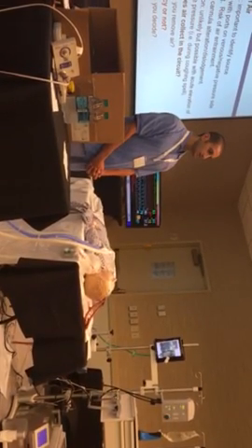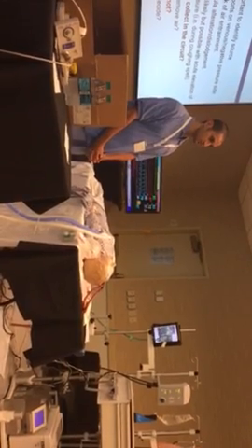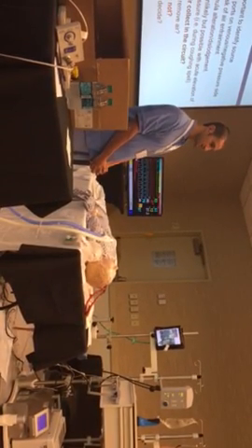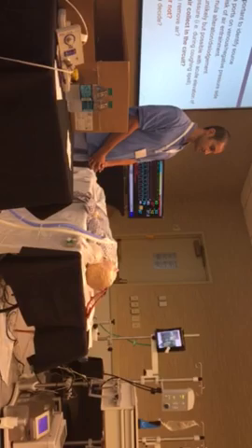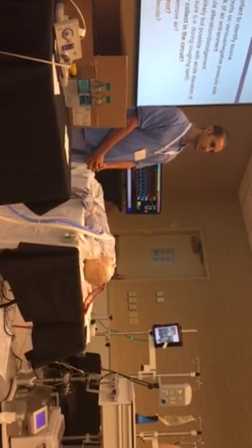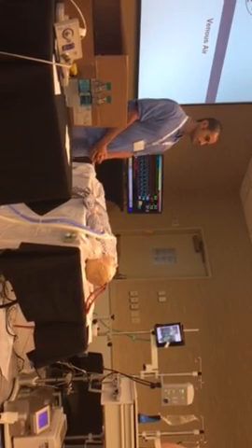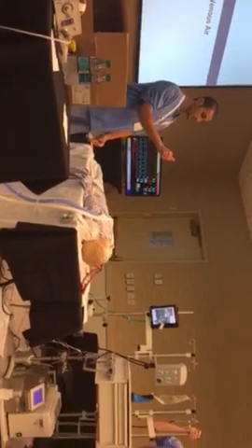Good. So air embolus in ECMO is one of those cases that we consider emergency, right? ECMO emergencies. There's a few reasons to clamp off ECMO, and air embolus is one of them. What is your approach to air embolus in an ECMO circuit? What are the initial questions you're asking? Is it the cannula, or is it some? If it's on. So one of the big questions is source.